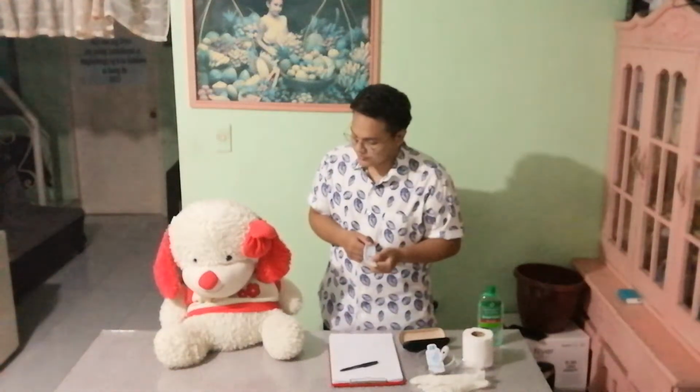For our step number 4, we need to activate the thermometer by pushing the trigger button. The reading is immediate, usually within 2 seconds. So after we got the readings, we need to note the readings. So Ma'am Love, you got 36.4 degrees Celsius, and that's within the normal range of body temperature.